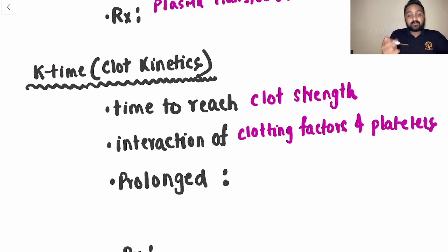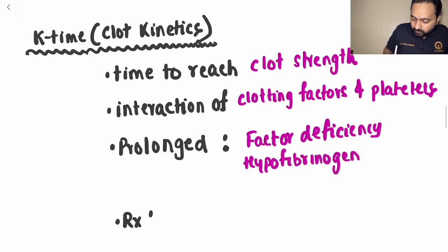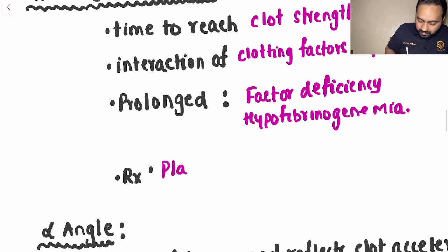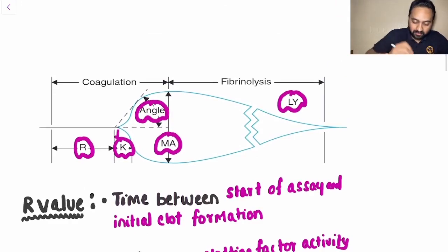So when is it prolonged? It would be prolonged if you have factor deficiency and in case of hypofibrinogenemia. Now what would be the treatment? The treatment would be the same, which is plasma transfusion.